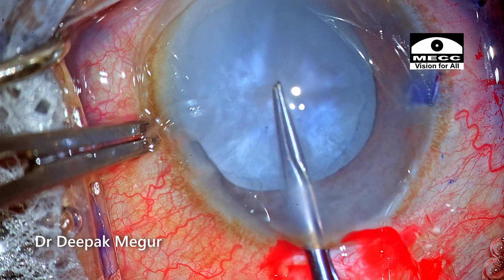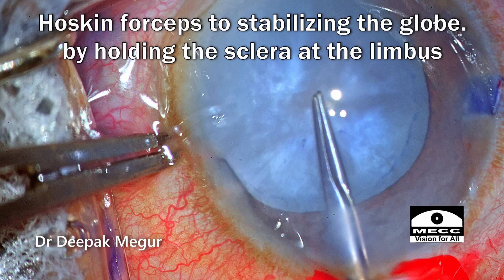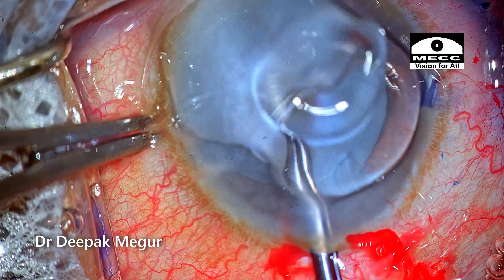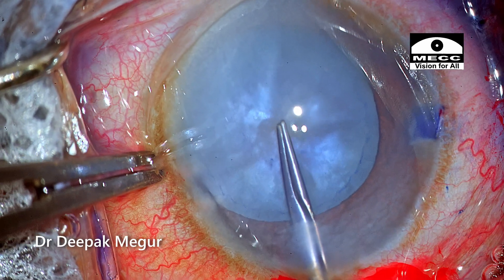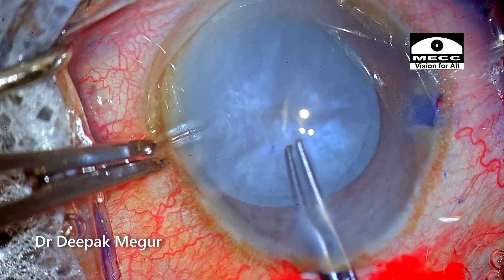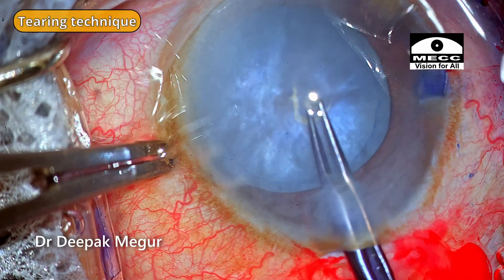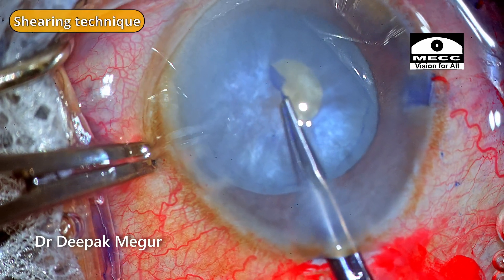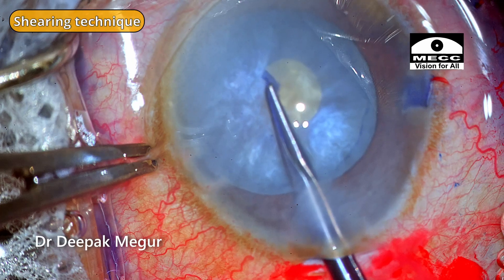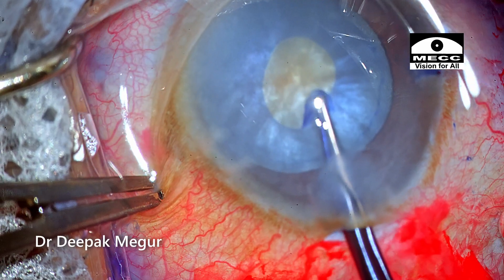A few modifications to note: I have not introduced a second instrument through the side port to stabilize the globe. Instead, I am using Hoskins forceps to stabilize the globe by holding the limbus. Since the chamber is extremely shallow, I don't want a second instrument entering the eye. As soon as I puncture the capsule, there is a hint of the capsule getting extended, but luckily it just stays there. I begin with more of a tearing technique where the capsular flap is held flat, then fold the capsule and continue the small rhexis using the shearing technique.